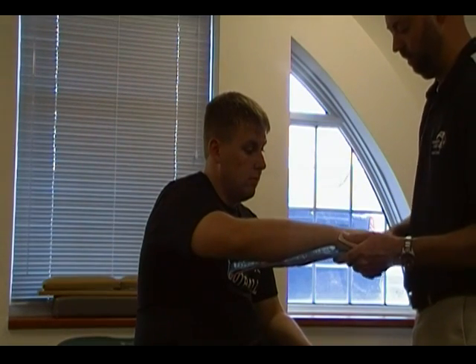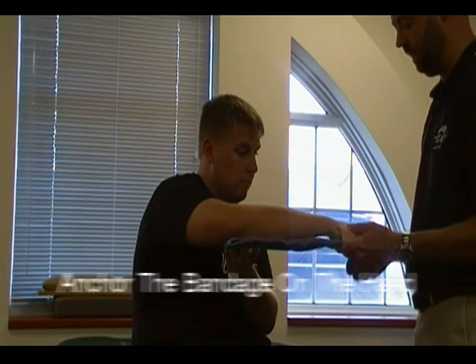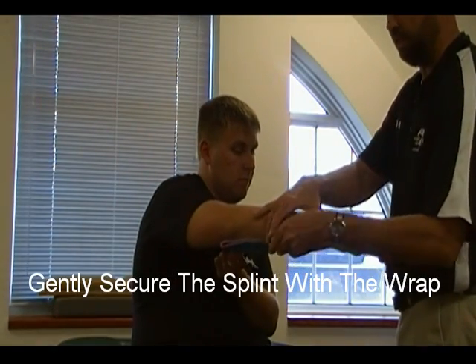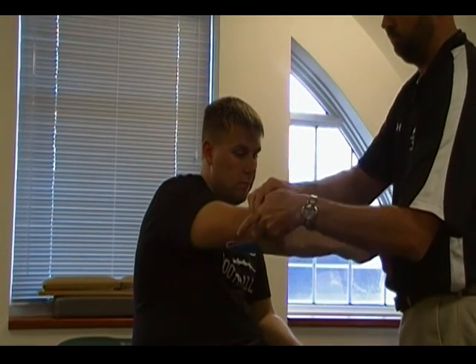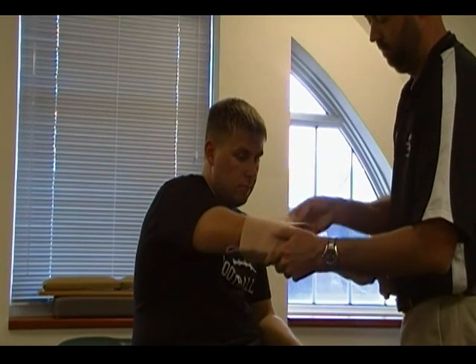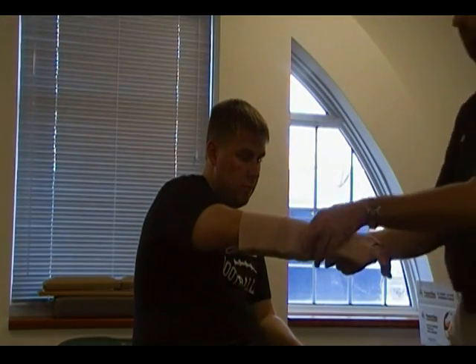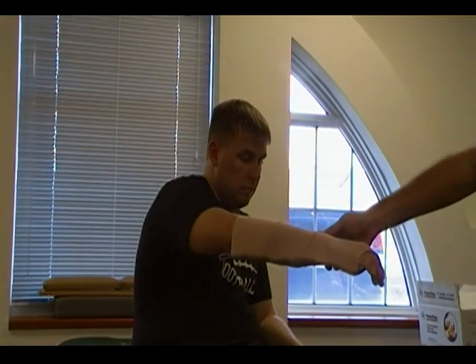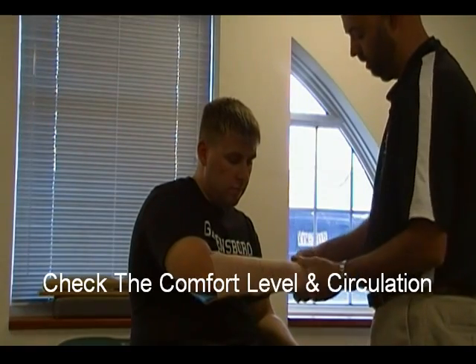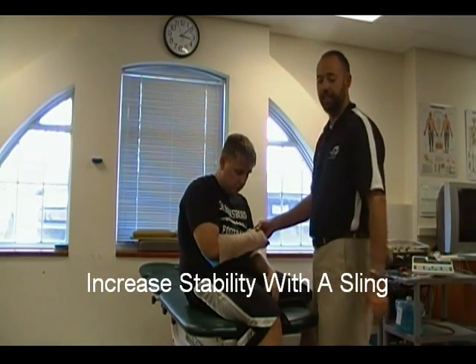Can you open your hand please? I'm going to anchor it down on the hand, providing a little bit of compression, and then I'm securing my splint lightly over the area of fracture but then securing it proximally. If I have excess, I'm just going to lay it down smoothly and then use clips or tape to secure it in place. Once I've done that, I want to make sure that the patient is in a comfortable position. I'm going to recheck circulation — can you feel that? — and then I'm going to place the patient in a sling so that I can transport.